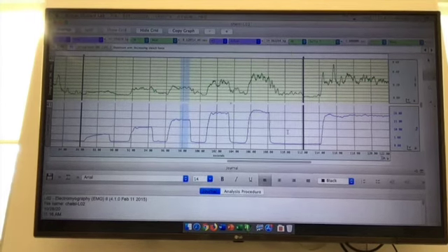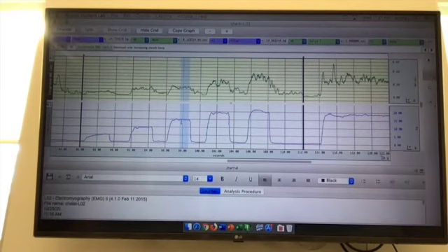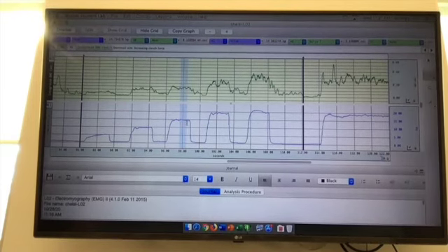Okay, so there are a few tools that you'll need. This analysis is going to be pretty simple, but for each of those stair steps of the increasing values, you are going to want to just highlight a section where it's pretty much a flat line at the top of that peak. You don't want to highlight the entire thing, because then it's just going to be taking an average of all of this lower activity here.